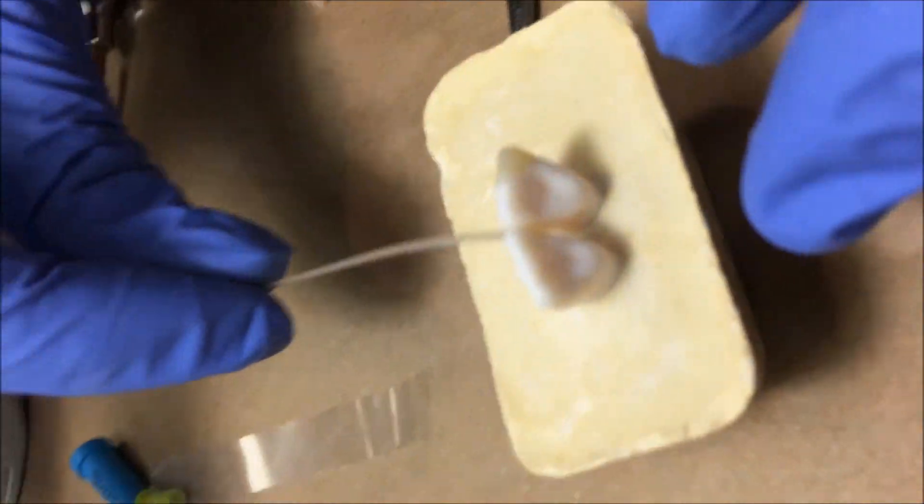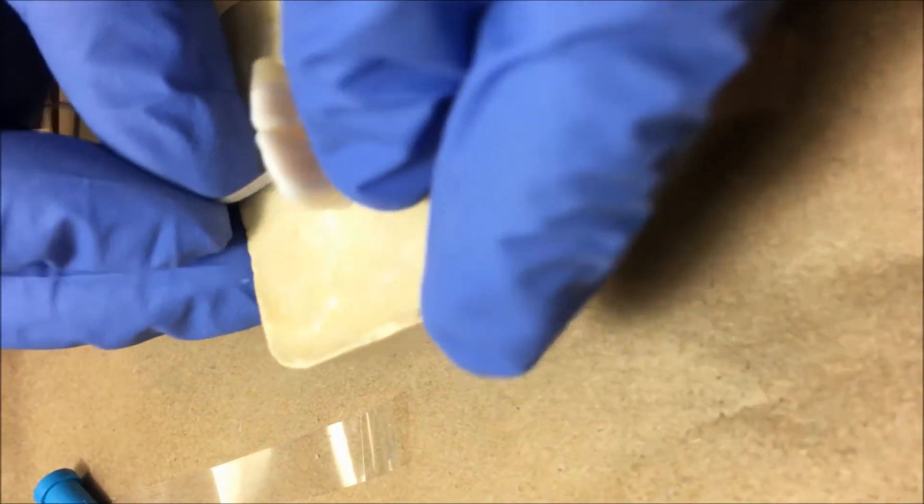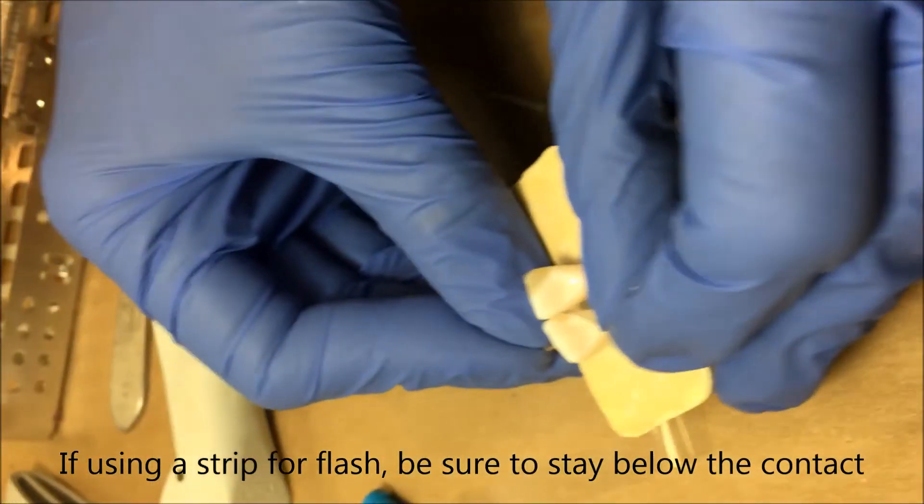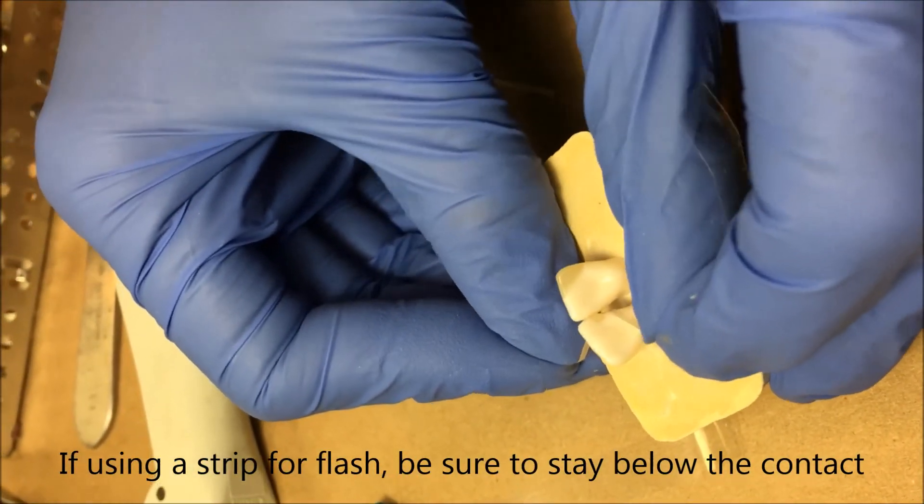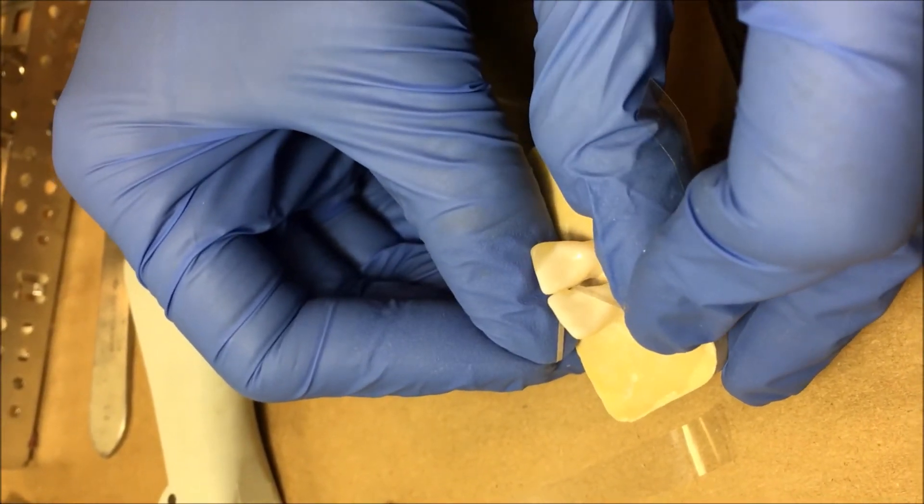Not stripping your contact is basically the advantage. Now in this case obviously if you're on a stone block I can just thread this straight through and sometimes you can do this with patients too. But the beauty is is now I can work right up to the base or the gingival seat without stripping my contact because it's nice and thin.